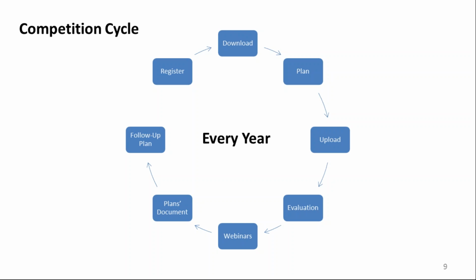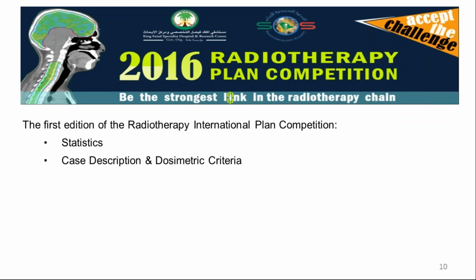prepared by the best planners worldwide per treatment planning system, and planners will be using this document in order to replan the same case. They have already submitted their own plan, but this follow-up plan will be based on the directions or guidelines or guidance of this document that we are preparing and selecting from the top planners.